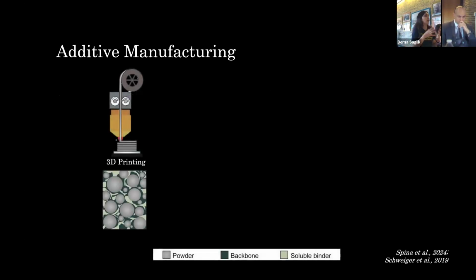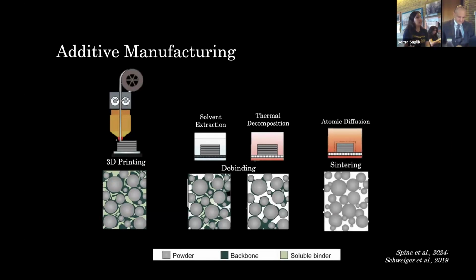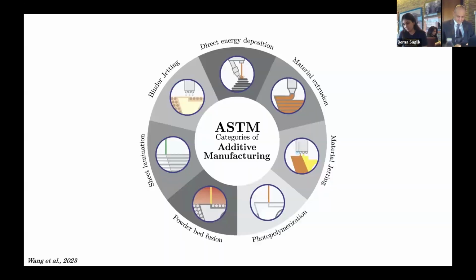Just in short, how most of them work is we do have the 3D printing technique, regardless of which technique we're using, that goes layer by layer. You can see there's a binder over there. So we do have an organic or inorganic binder, and then the actual powder, which is that ceramic powder that we're looking for. That binder acts like the scaffold that just holds the material together. And then once that is printed, it's printed in its green state, it goes under the debinding process, and that usually takes several days to get done. And then at the end, we go ahead and sinter that just to get those particles together and solidify that material. So this is how it usually goes from green state, after debinding, and then we get that final product after sintering.